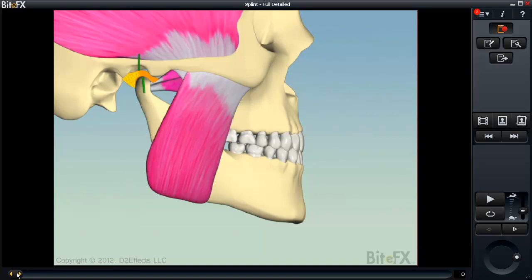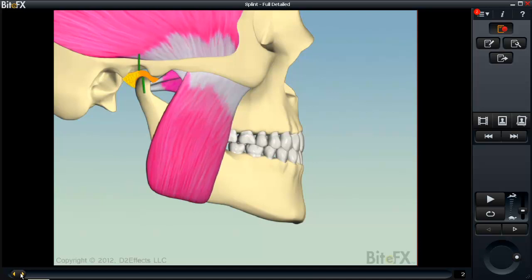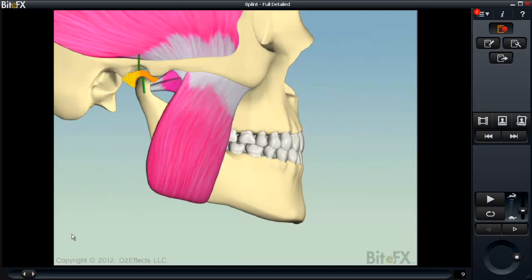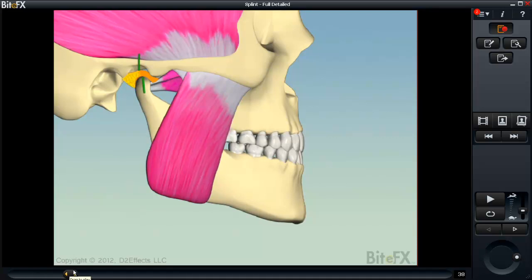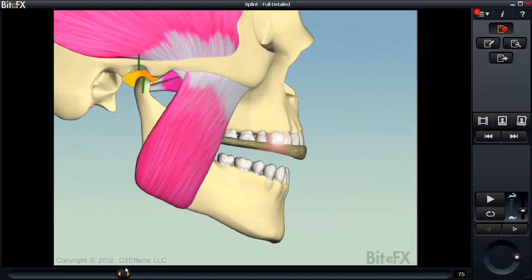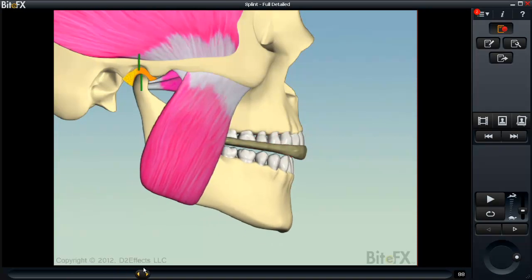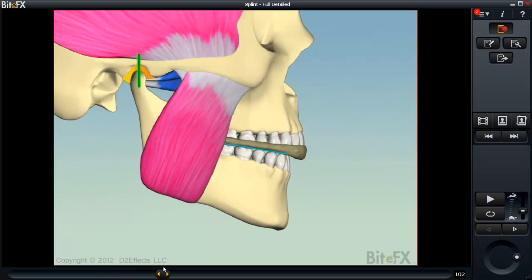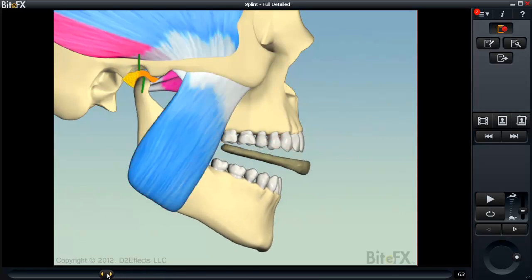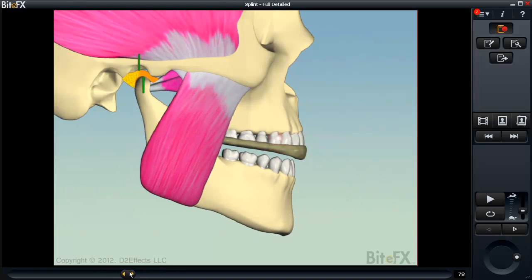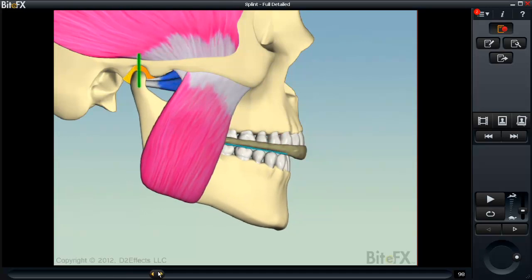Here it is going in place. It's fully seated. As they close, the joint seats, and the pterygoid muscles relax. This animation has the details of the splint, which I find effective because now they know what anterior guidance looks like and what proper tooth contact looks like. The pterygoids are fired up, the jaw joint is out of socket in their habitual bite — this is where they clench at night. We place the appliance in. It seats. They close on it. The joint seats. The pterygoid muscles relax.